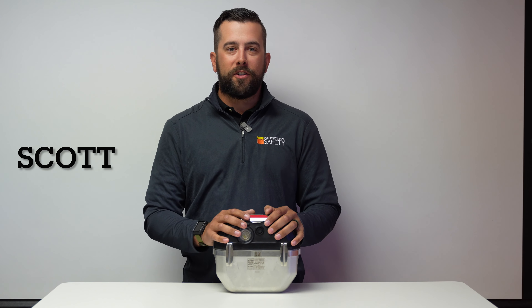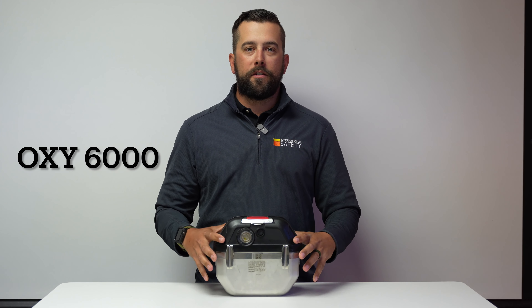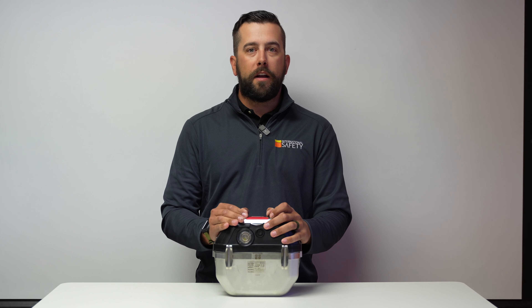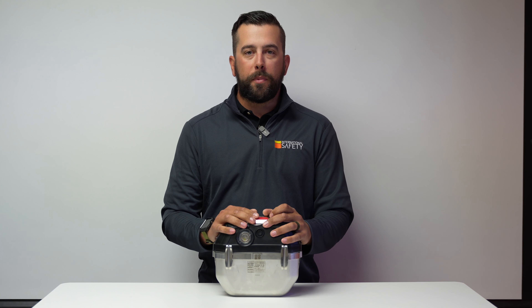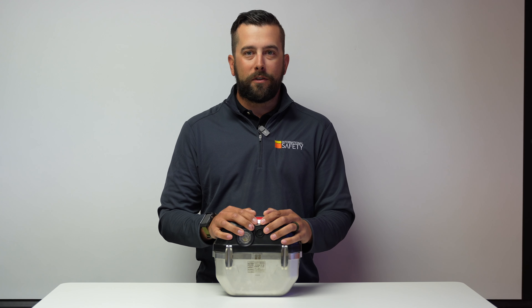Hey everybody, it's Scott here from International Safety. What I've got in front of me here today is an Oxy 6000 from Draeger. We're going to actually open it up today, show you how to don it, and also show you how to properly inspect it before each shift. So stay tuned — I look forward to going through this with you.